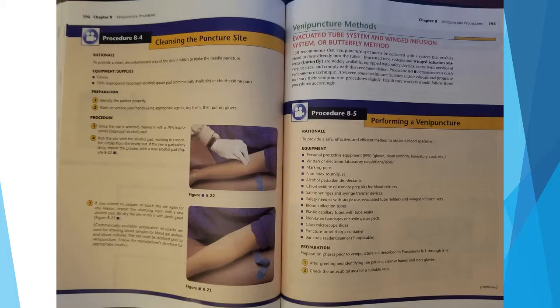Venipuncture methods: evacuated tube system and winged infusion system or butterfly method. CLSI recommends that venipuncture specimens be collected with a system that enables blood to flow directly into the tubes. Evacuated tube systems and winged infusion systems, such as butterflies, are widely available, are equipped with safety devices, come with needles of various sizes, and comply with these recommendations.